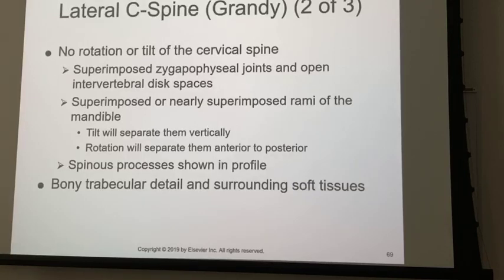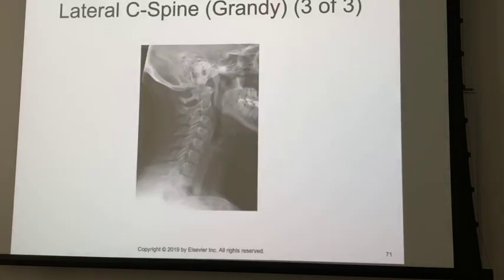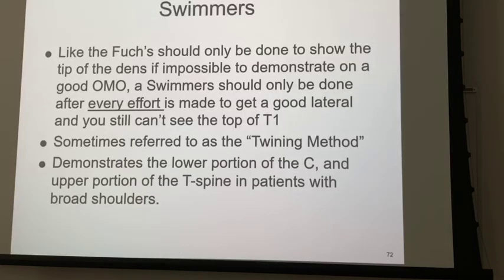Alright, so a little better. We see the sella turcica. You see that little U-shaped thing right there? That is the sella turcica. You can't really see the posterior or the dorsum sella all that well on this one, but you can see the anterior arch of C1, and it doesn't look like they've got any kind of displacement of C1, C2. But 1, 2, 3, 4, 5, 6, 7, and T1. Relatively speaking, that's a better lateral C-spine.